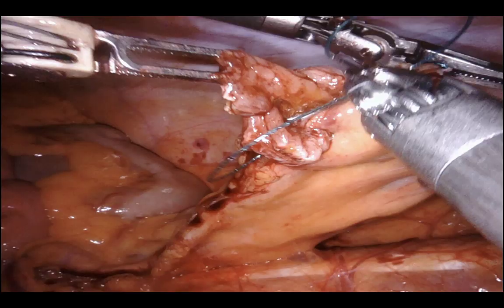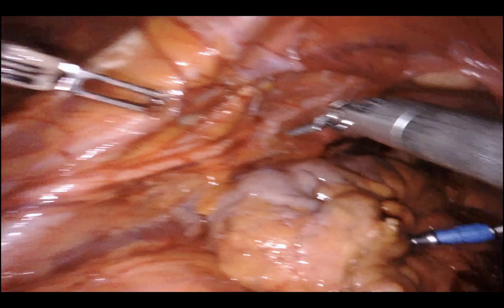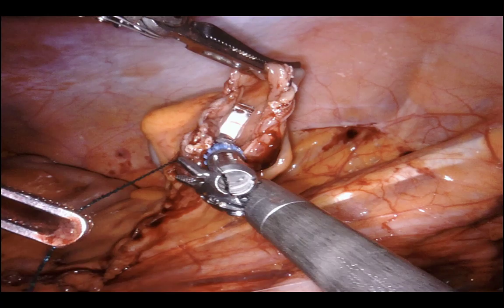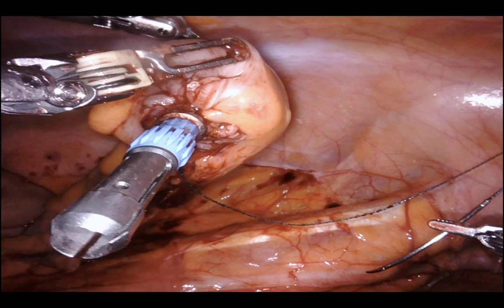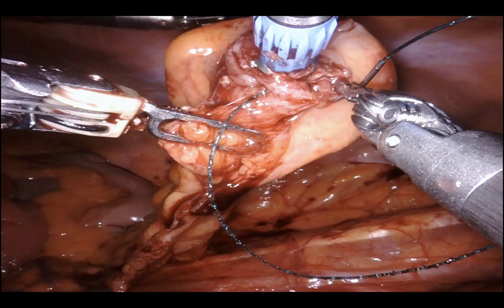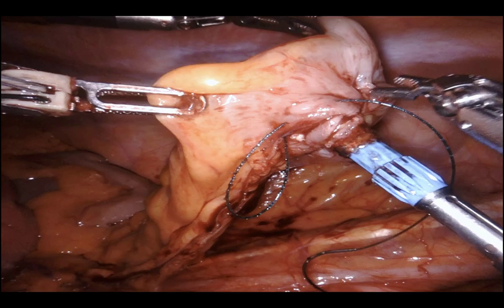Third arm grabs at the 12 o'clock position, left hand pulls down at six o'clock, anvil is advanced in place and the suture is cinched down tight around the descending colon conduit. In the majority of cases I end up doing a second round with the same suture if the cuff doesn't cinch down nicely enough. More and more regularly I'll also take a vicryl endo-loop and cinch that down tight around the base of the anvil.